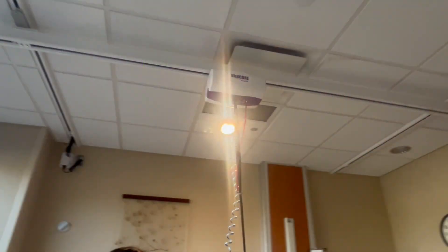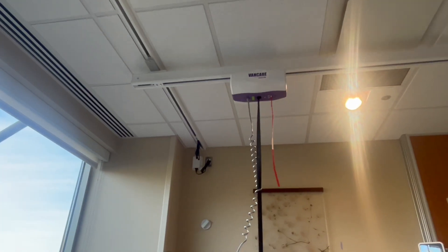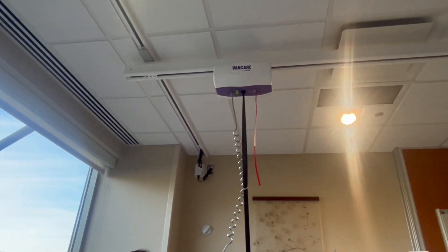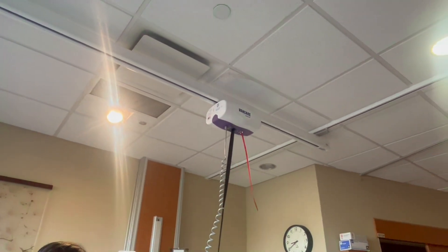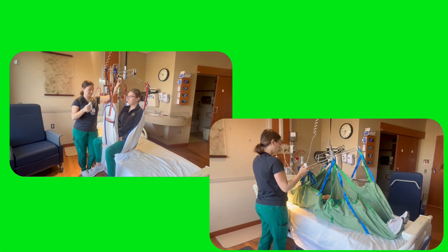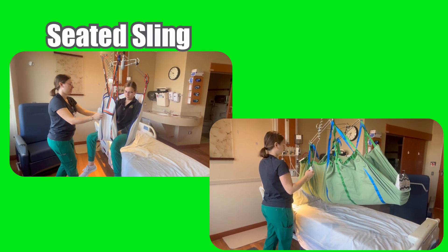The second part of the lift system is the track, which is built into the rooms on the South Tower. It is an XY movement system, meaning it can move forward and back, and right and left, allowing for full and easy movement anywhere beneath the lift track. The third piece of this system is the sling. We have two styles of sling available at Trinity Livonia: the seated sling and the supine sling.